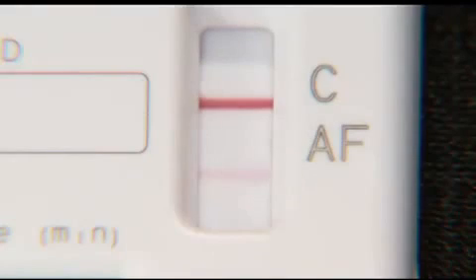Concentrations of the proteins in the positive sample are intentionally set at the lowest detectable level. Therefore, it may take the full twenty minutes to show a light positive line.